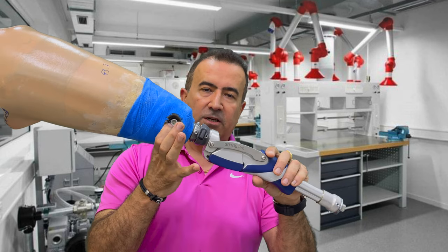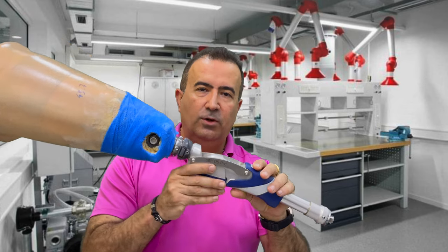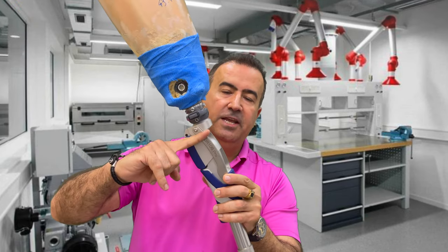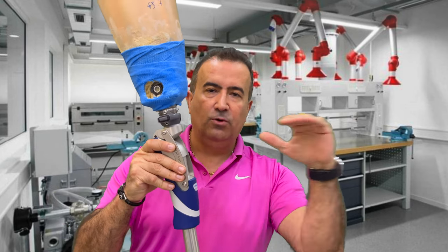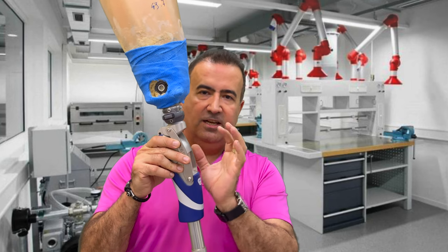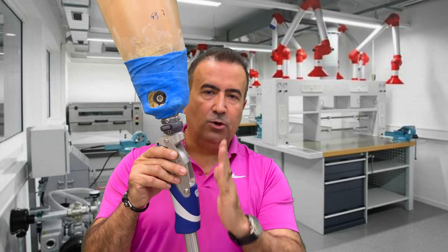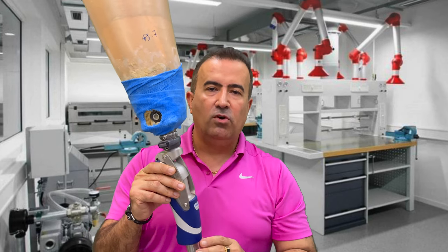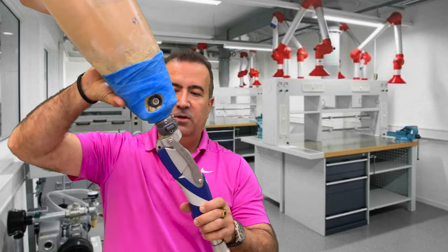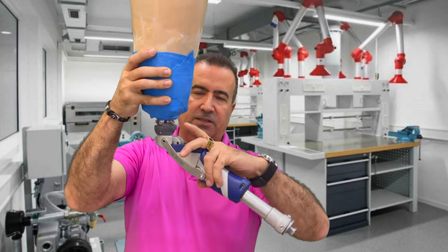the knee joint. Especially when you have a long stump, you have to calculate it exactly to know that the size from the knee to the ground will be equal to the sound side. Otherwise, while sitting, the prosthetic will not be cosmetically equal, but for standing and for walking, the patient will not face any problem. Now, as you can see here, we need just to bend it now because the patient is not present.